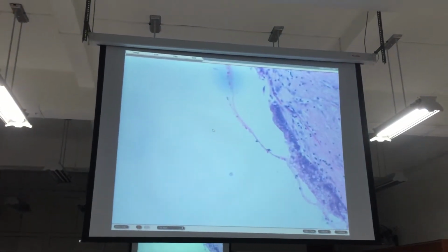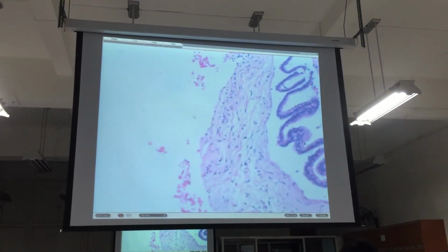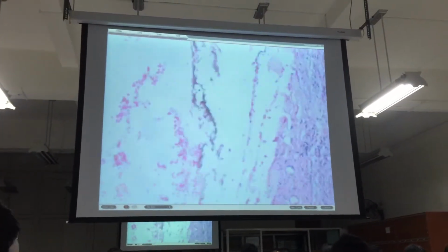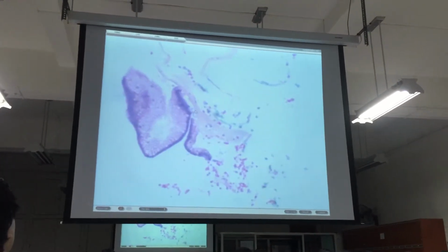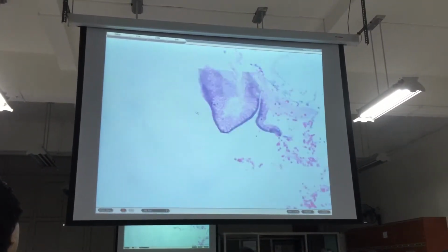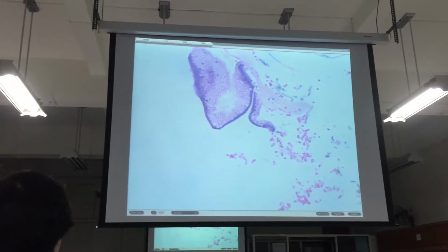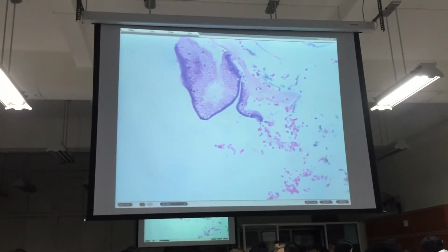This one? What does the epithelium look like? Also this one is epithelium. Okay, what's the lookalike of this epithelium? Okay, this one. It is somewhat detached. This one, this epithelium. Okay, tall columnar and basally oriented.